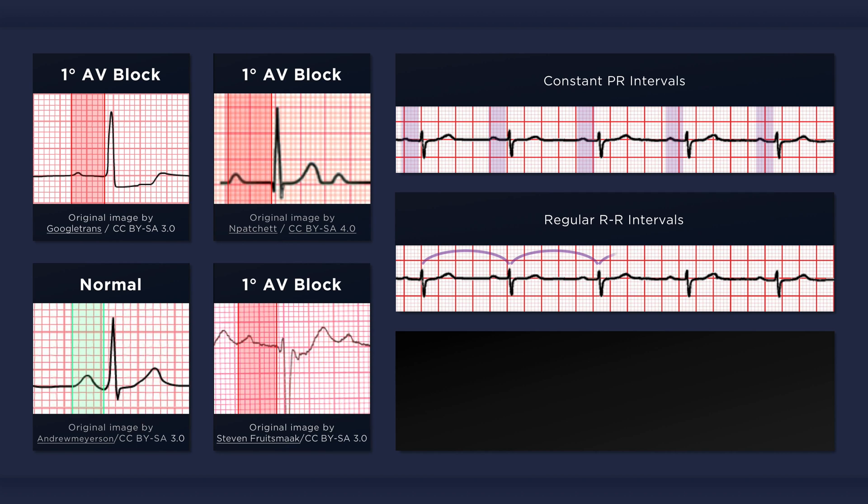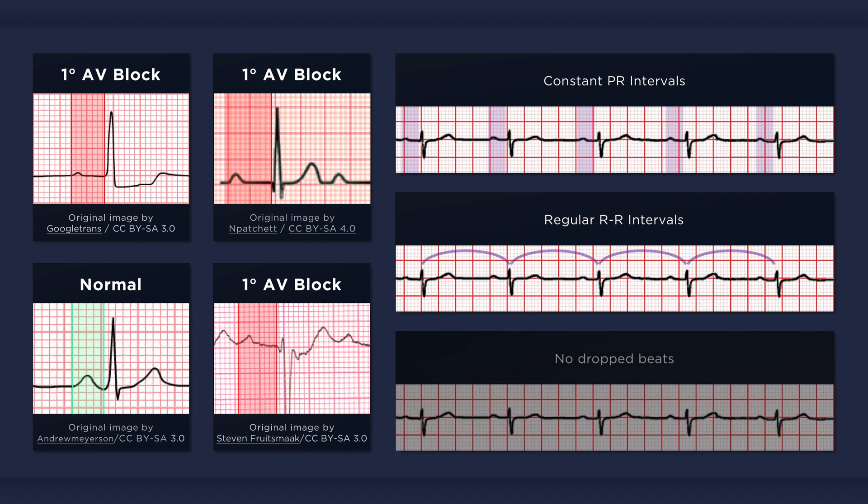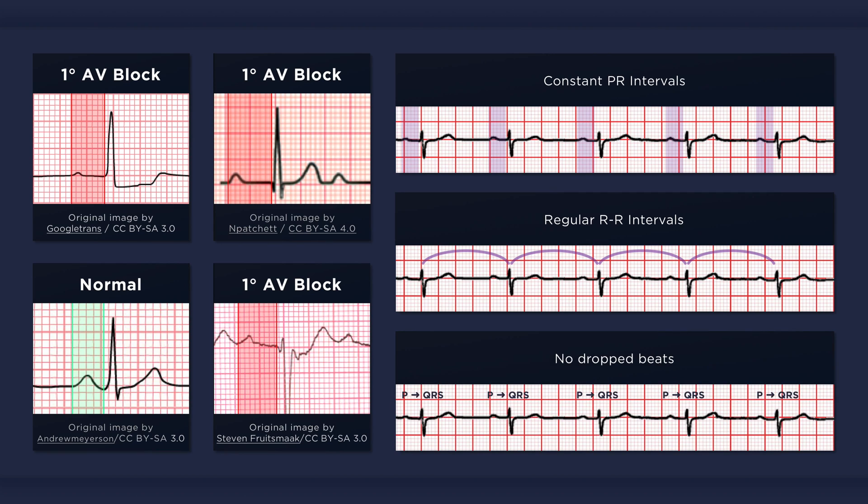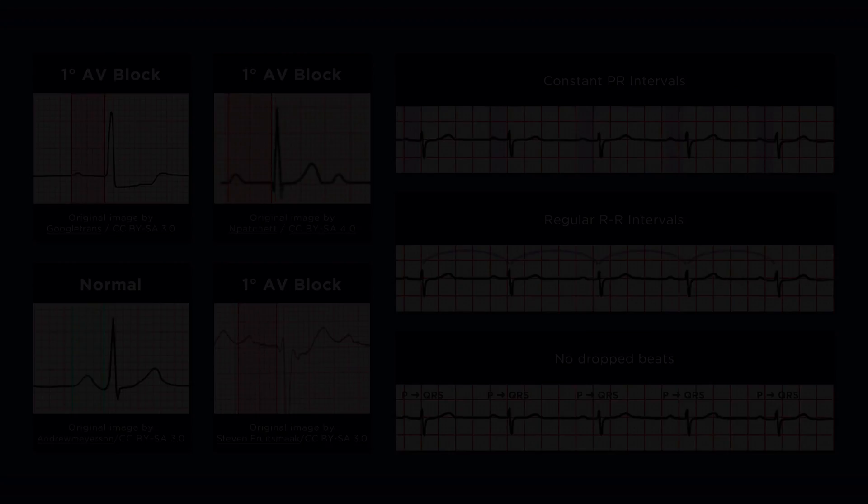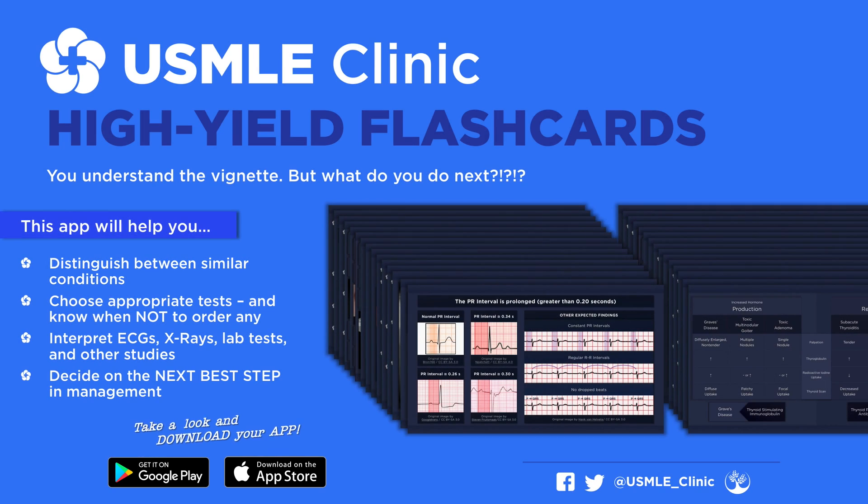The RR intervals are consistent and the atrial ventricular rates are equal. First degree AV block does not result in drop beats. Every P wave is followed by a QRS complex, that is the AV conduction ratio is 1 to 1. If there are P waves that are not followed by QRS complex, then you should consider the possibility of a higher grade block or another abnormality.